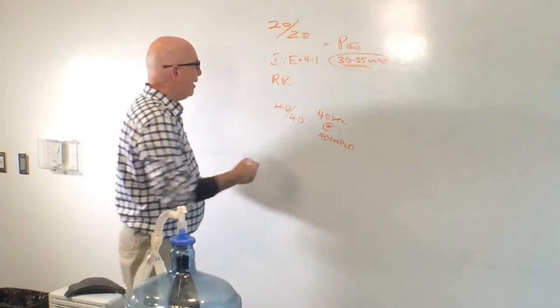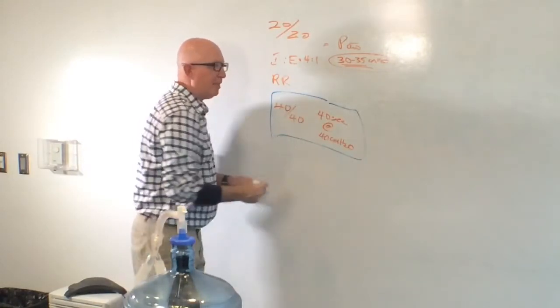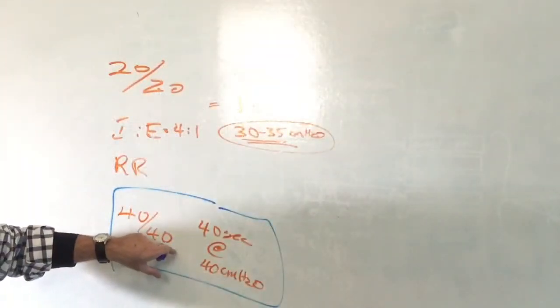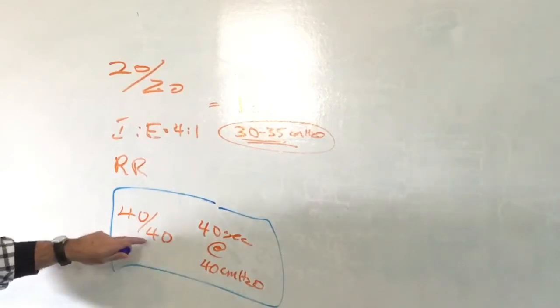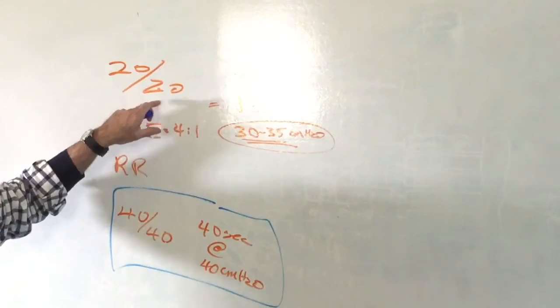So just to wrap this up, the 40-40 maneuver is the one that's probably been researched the most. So at the sending facility, if they're on a ventilator and there are staff there that are comfortable with performing this maneuver, then perform that one. Clamp your endotracheal tube and make the transfer over to the LTV. If you can't perform this one for whatever reason, then this is the reasonable option in that case.